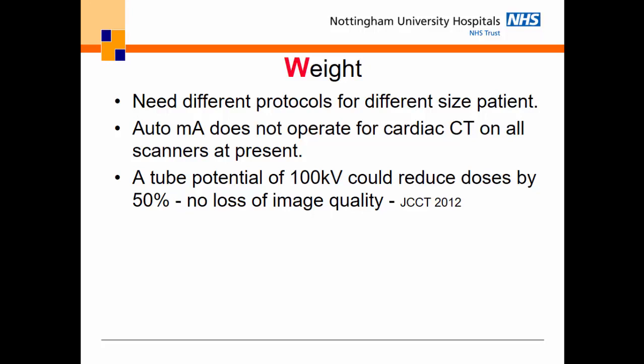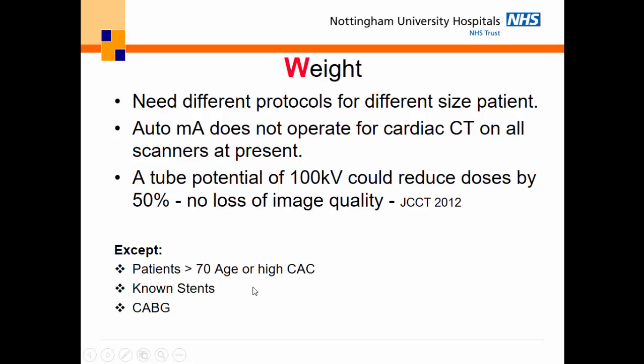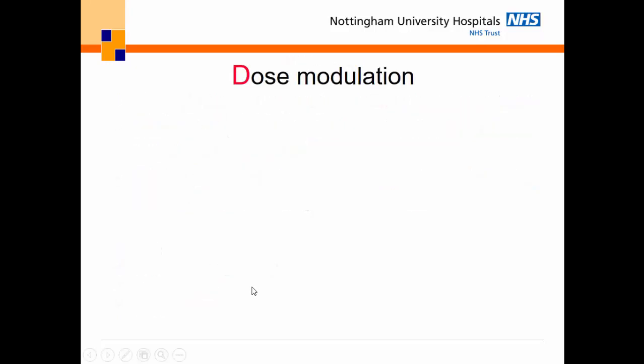Also, as the patients change in terms of size, and I'm really looking at how big they are, not how tall they are, you can change the kV to reduce the dose without loss of image quality. And again, there's a paper I think you've got for that, except with certain conditions that you need to exclude it for because of the effect on image quality.